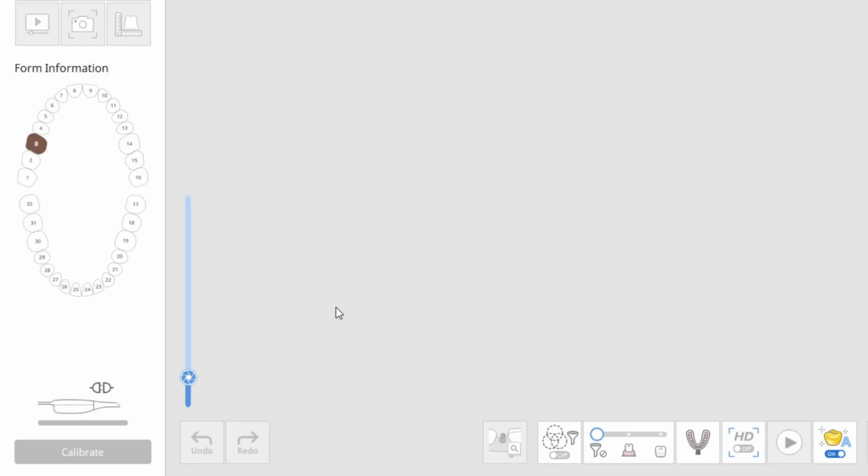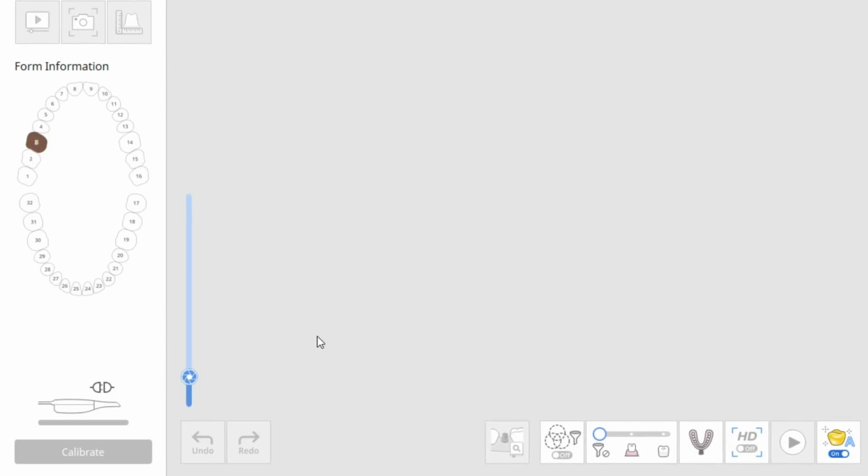You don't want it to see saliva. So it's good at hiding things, and it's great for new users who could get distracted, or have the camera distracted, with the lip, the tongue, and all these other things that move. Conversely, if you're an expert, an advanced user, you know exactly how to manage the tongue and the lip and everything else that may get in the way.